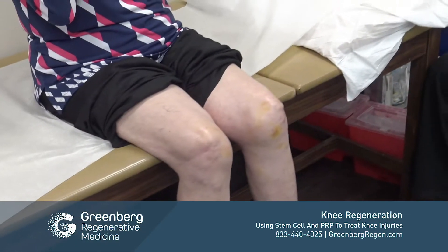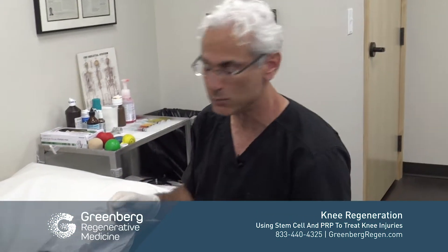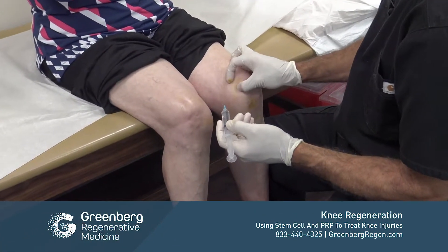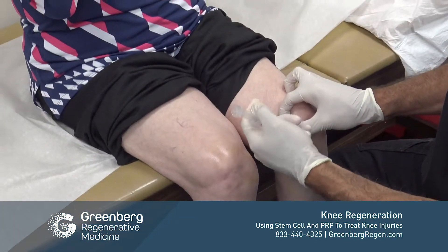Our next step is to perform a nerve block, which is to make the patient more comfortable. We're going to block both the geniculate nerve and also the saphenous nerve.